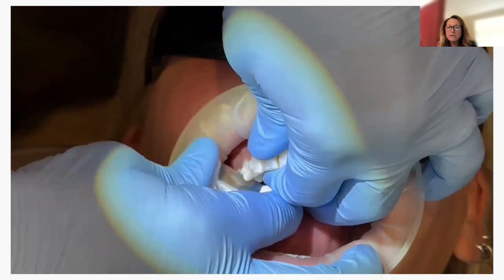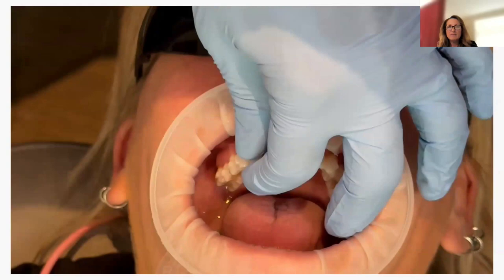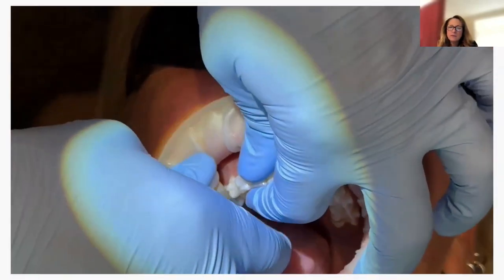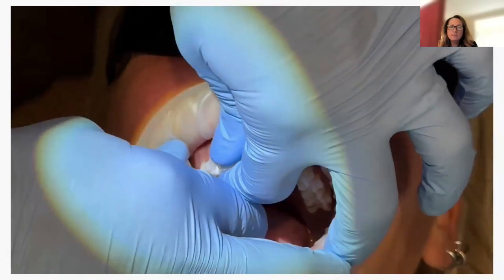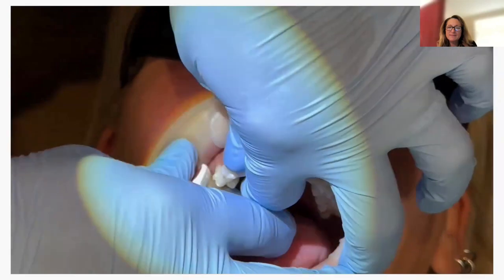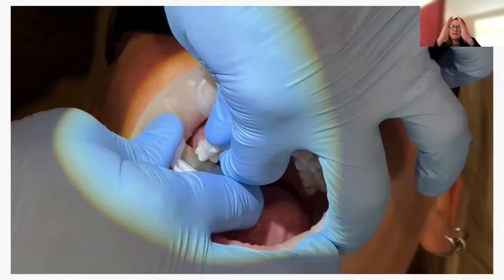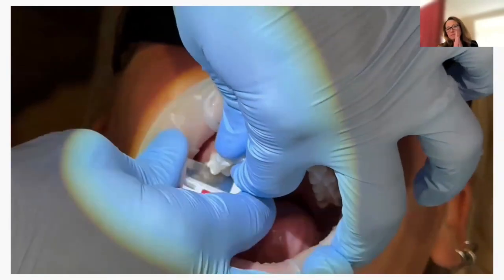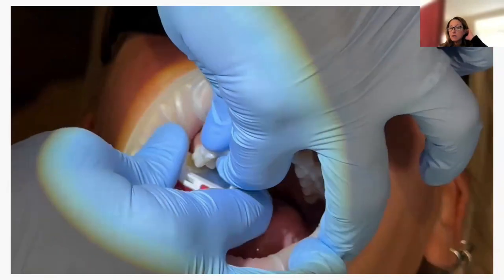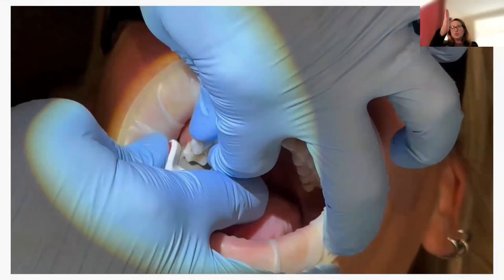Teeth don't grow back, hair does. So I say start off slow, and that's why I would not suggest a double-sided. I have seen too much IPR done before, and that's not a great outcome, right? Because teeth are supposed to be nice and curved. I know that they say you can put a disc on a slow speed to do your IPR. You don't have as much control of it, and it usually will do flat.